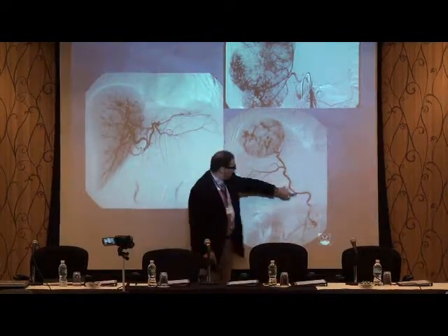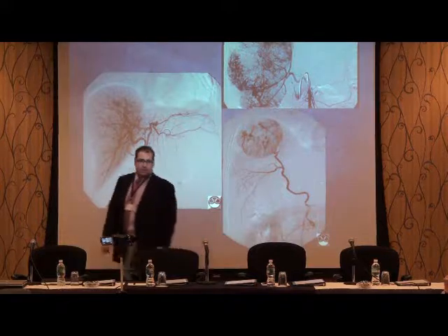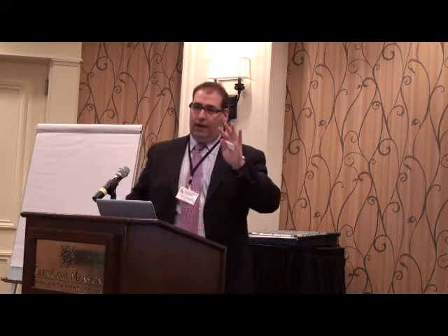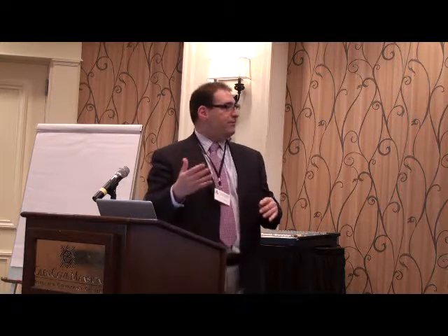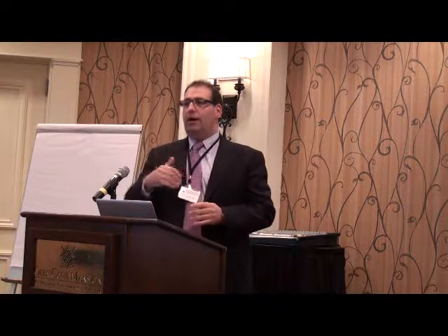We now have catheters that we can put right here and embolize right from that point and spare the rest of the arteries that may branch off and supply normal liver. So there's really not a tremendous role for preventing the reflux or the non-target, off-target embolization that may have potentially been one of the complications or risks of older technologies.